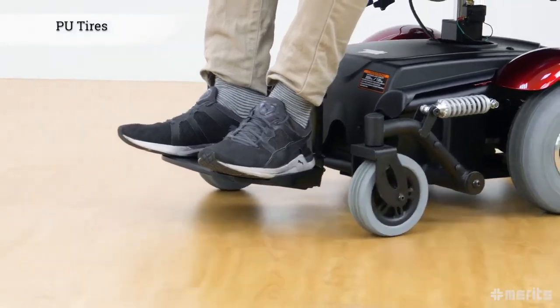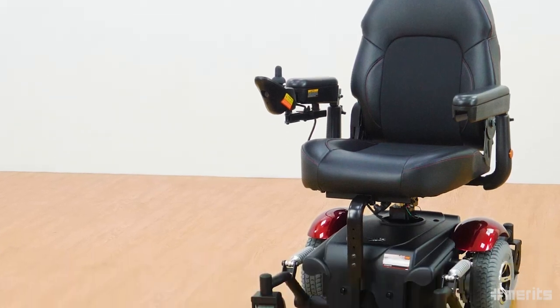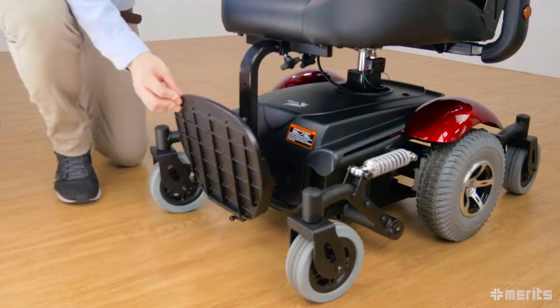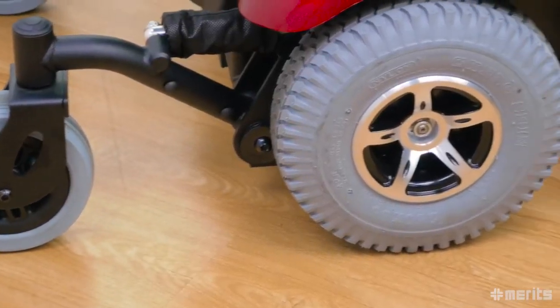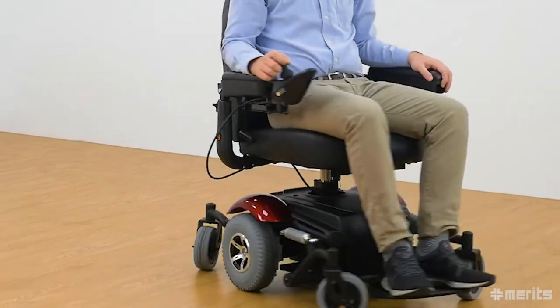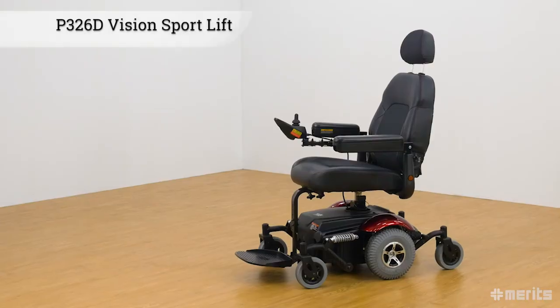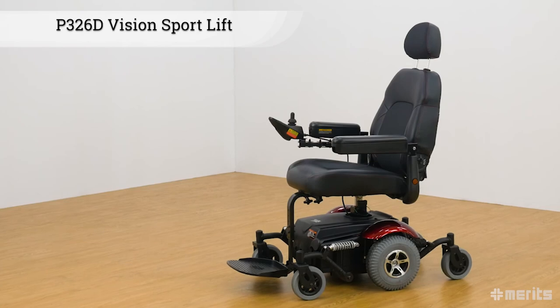The polyurethane foam tyres rule out the possibility of a flat tyre. The Meritz Vision Sport Lift P326D is an extraordinarily rugged and powerful mid-wheel drive power base wheelchair, virtually identical to the P326A with its six-wheel design, unparalleled stability and manoeuvrability, but with the added versatility of an elevated seat. The Vision Sport Lift P326D lets users reach new heights.